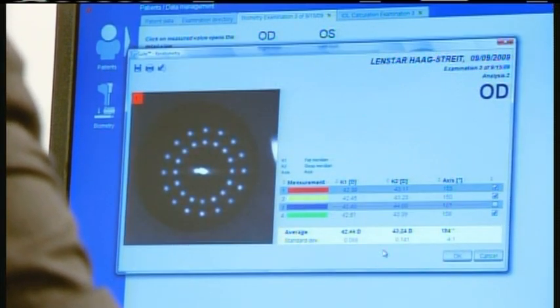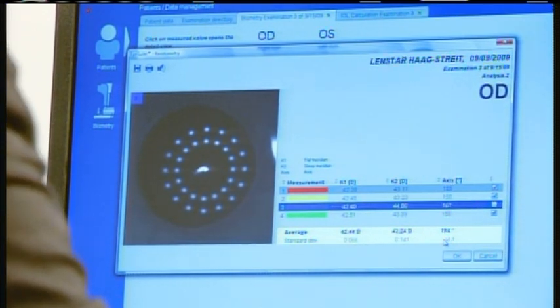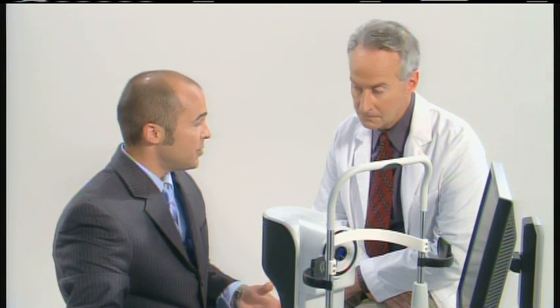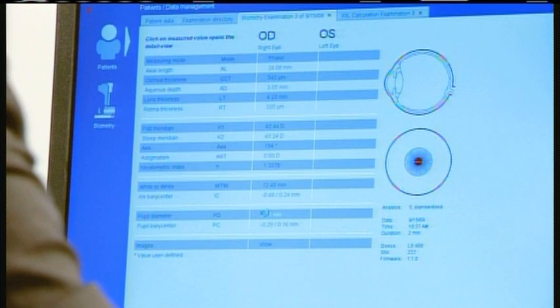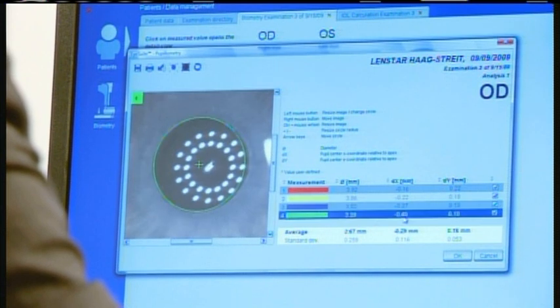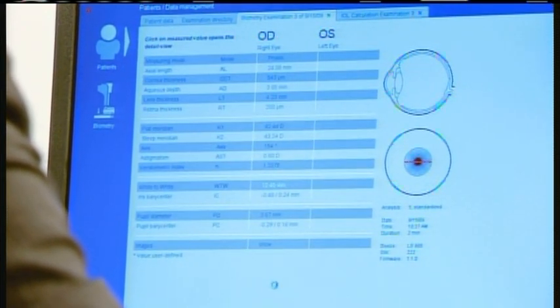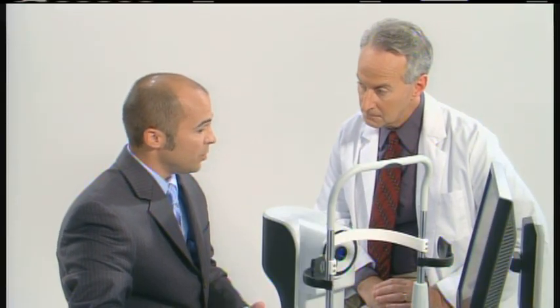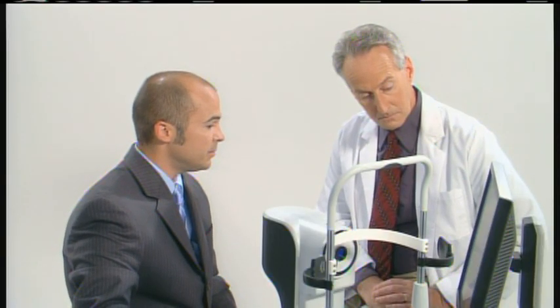We can look at the keratometry as well. This scan was automatically excluded because there was a little bit of a reflection, so it automatically kicked it out. The interesting thing about this is it actually captures the keratometry on the central visual axis of the eye — not necessarily the center of the cornea, but actually the central visual axis. We can also look at the pupillometry readings to show how the pupil measures up, going through each individual scan. If you need to recalculate any of these measurements, it's just a simple mouse click. We can do that for the white-to-white as well. Since we have a camera inside the camera, we capture a black-and-white image or a green-red-free-type image, and we can switch back and forth between the actual camera picture images.